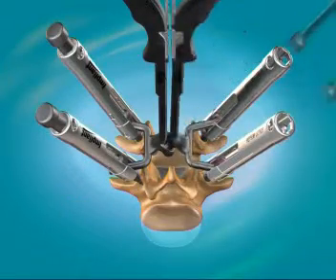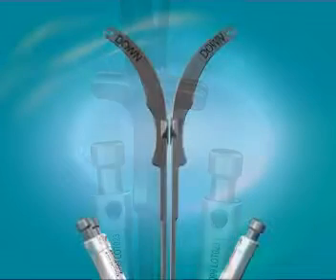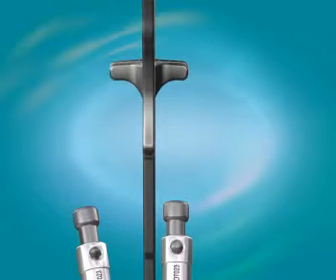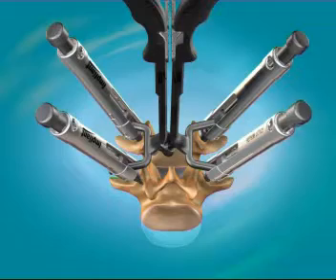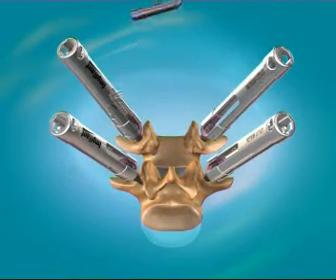When both sides of the gauge are perfectly adjusted, such that the halves are parallel in both planes, this verifies that the pedicle screws are adjusted and that the TOPS system will properly sit into the pedicle screw heads. Remove all 4 temporary set screws and the gauge.